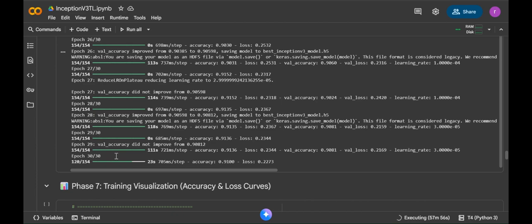Finally, we implemented a YOLOv11n classifier, a model known for its high-speed and real-time image detection capabilities. Although YOLO is commonly used for object detection, we adapted it for classification purposes to see how well it performs in this medical context. By comparing these 4 architectures, our goal was to determine which model performs best in terms of accuracy, precision, recall, and F1 score.